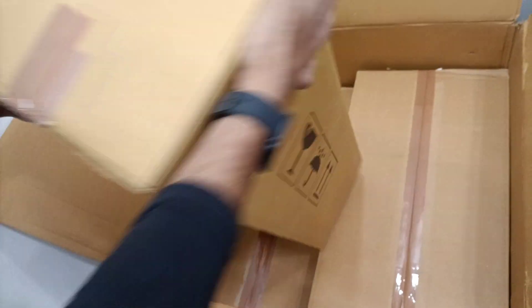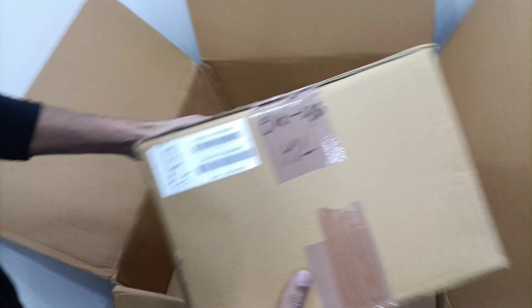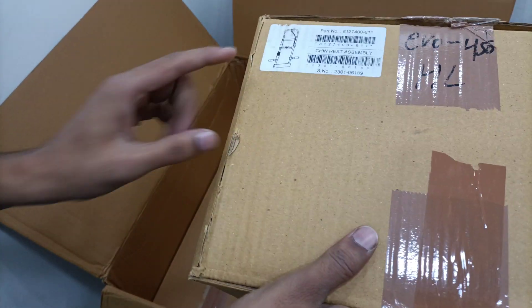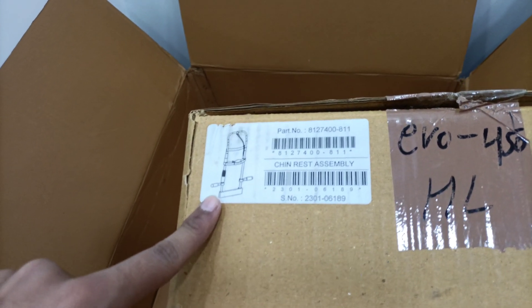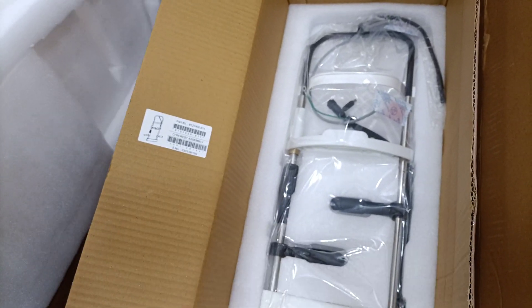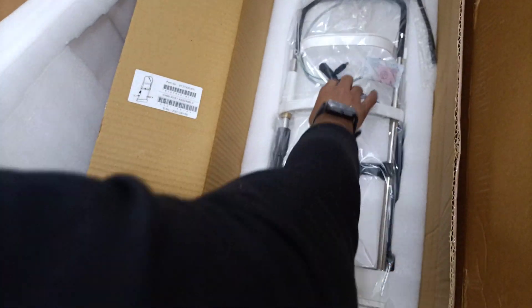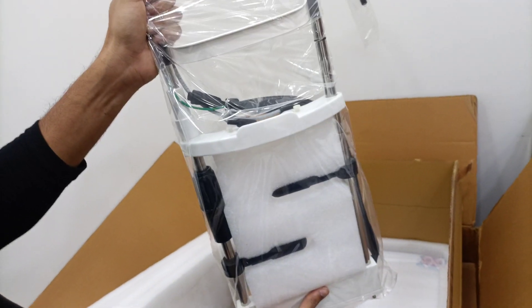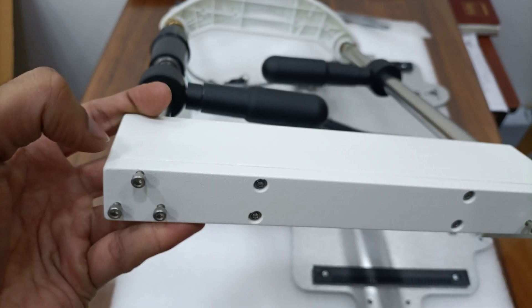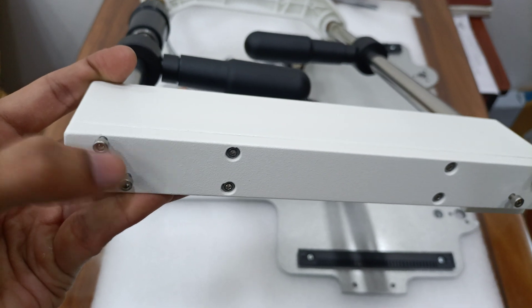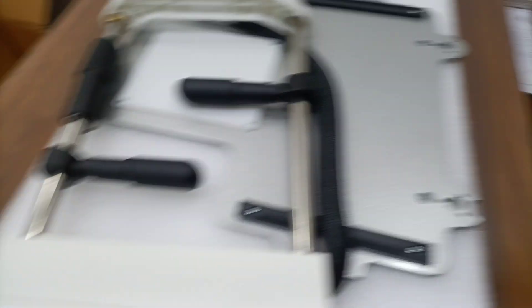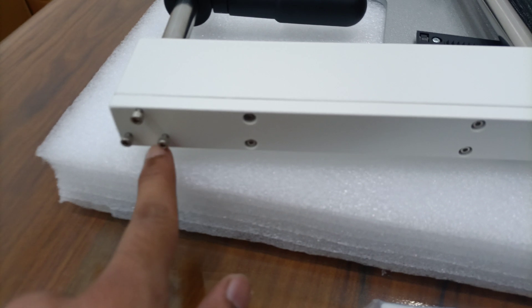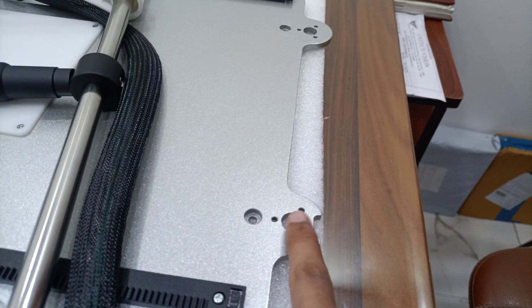Second box, for chin rest, EVO 450. This screw will be tight here, this screw will be tight here.